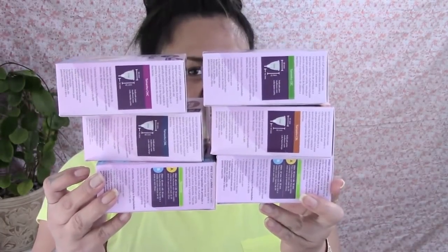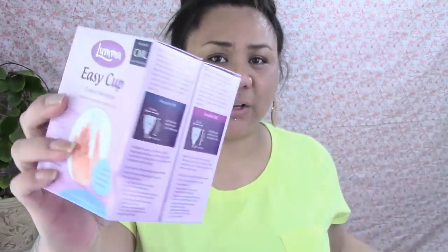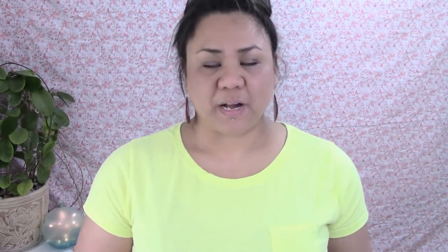I ordered the three different sizes in the Korui cup and also the six different sizes of the Luma cup. The Luma cups made for a high cervix are called free cup, and the cups made for a low or high cervix are called easy cups. I'll take you down to the table and show you what you get when you order one of these cups and give you a little bit about them, even though this is just an unboxing.